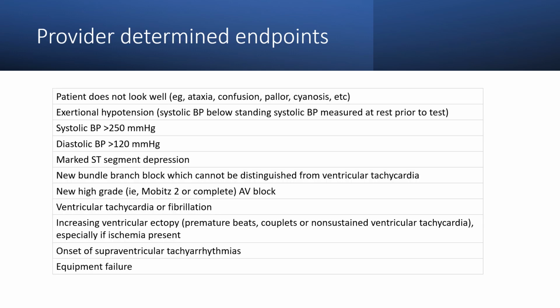There are reasons when you, as the supervising person, will decide that you should stop the stress test, despite the patient might say that they can continue. The list of things is on the slide and include how the patient looks, what are their numbers, and what ECG changes are you seeing.